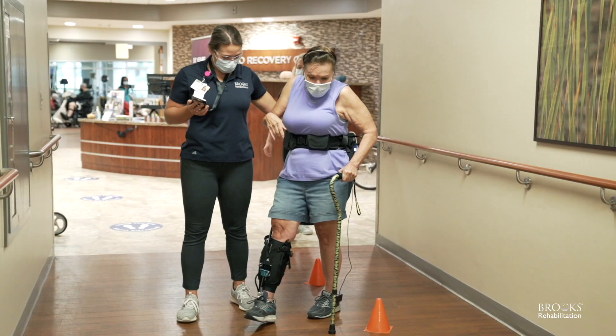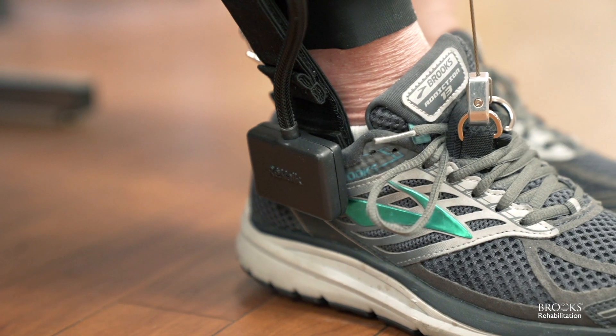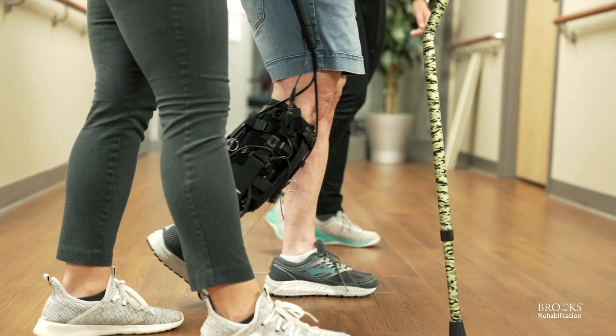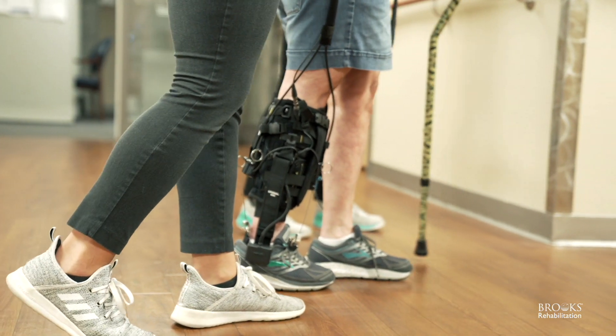The Restore is a soft exosuit. It was developed out of Harvard University. It essentially works mechanically, so there's no stimulation or anything like that. It's a foot plate in the person's shoe that mechanically dorsiflex and plantarflexes based on the patient's gait cycle. This product is smart in that it responds to the patient's gait speed, step length, and things like that, and reacts in real time.